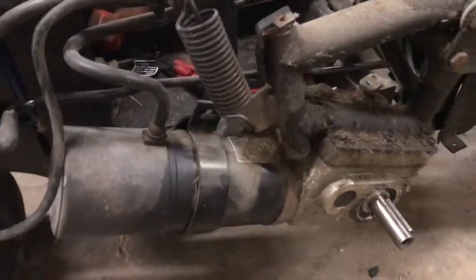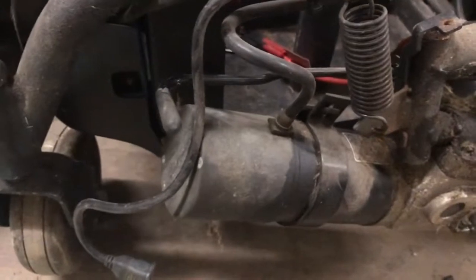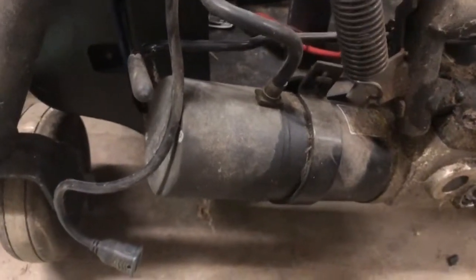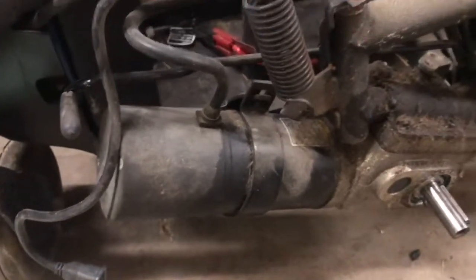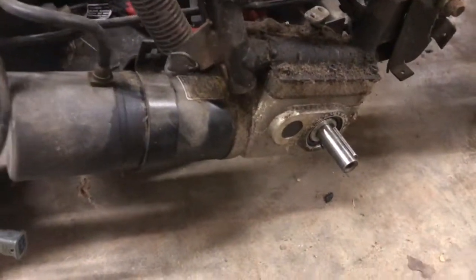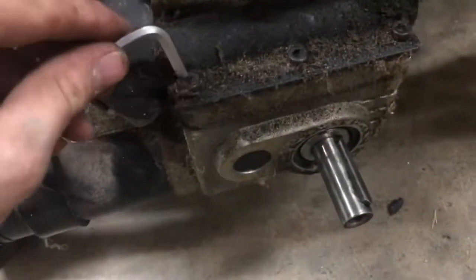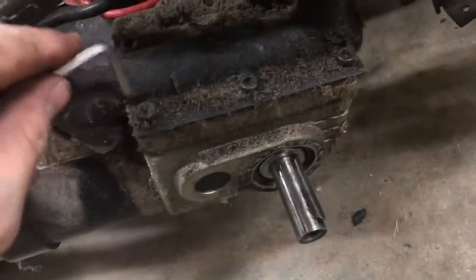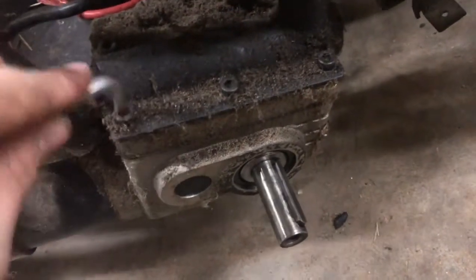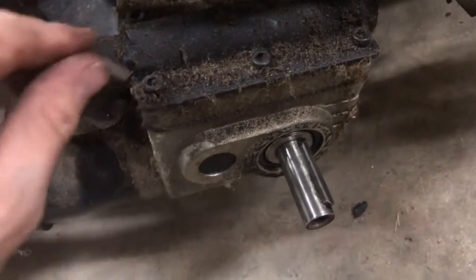So now you want to work on getting the motor out. Let me see, typically 5mm, what they usually all are. And if you do lose some of these Allens, usually Ace carries them. I haven't had much luck at Lowe's. 5mm. You definitely want to make sure you get the right size, or you will actually crack the gearbox.